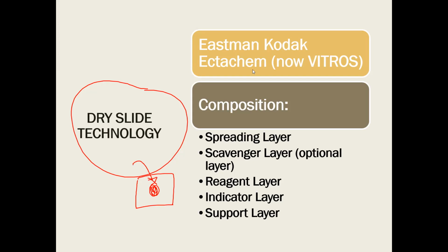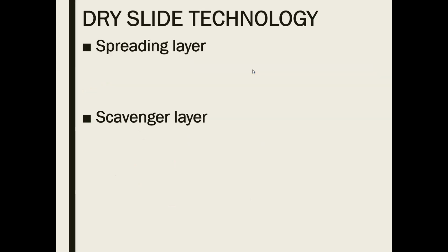Wala po siyang liquid reagent na tinatawag. Okay? So when we said dry technology, there are two things that I want you to remember. There is a spreading layer and there is a scavenger layer.